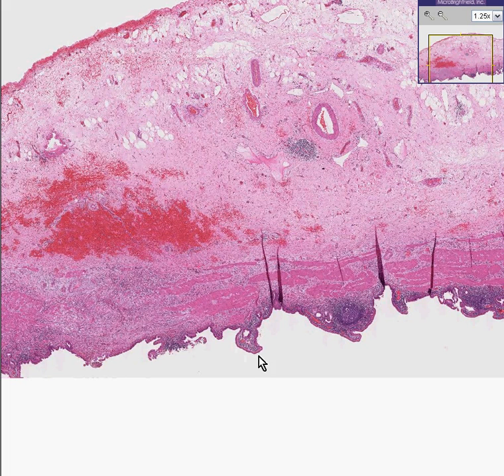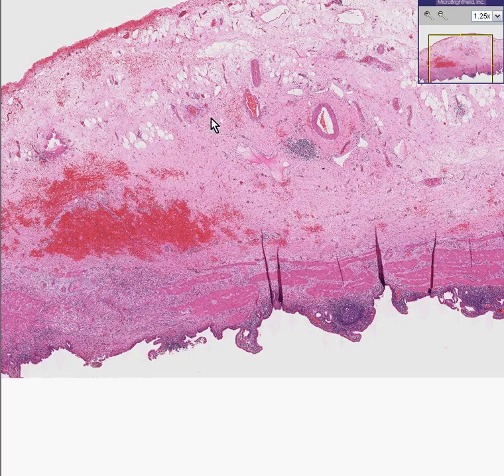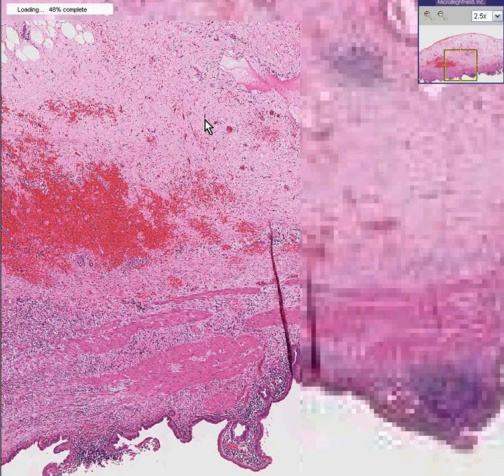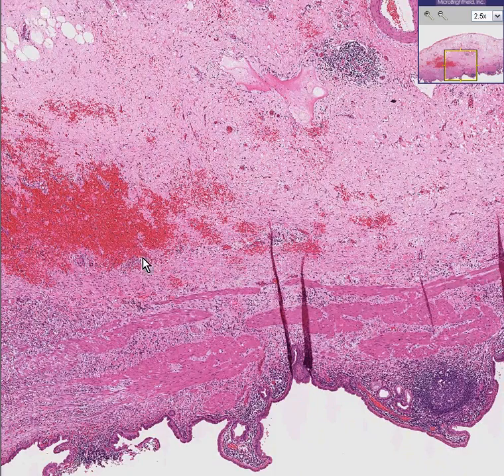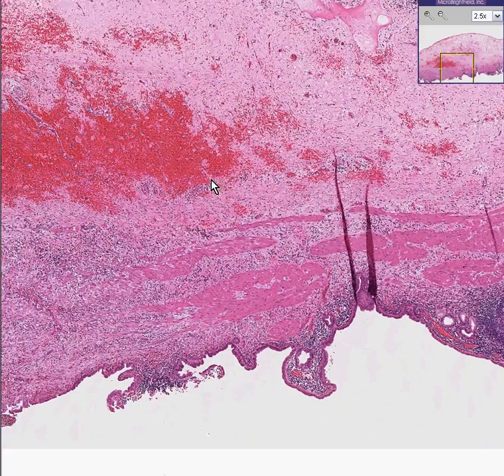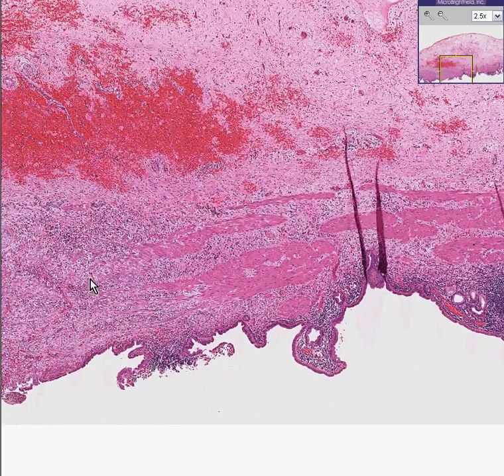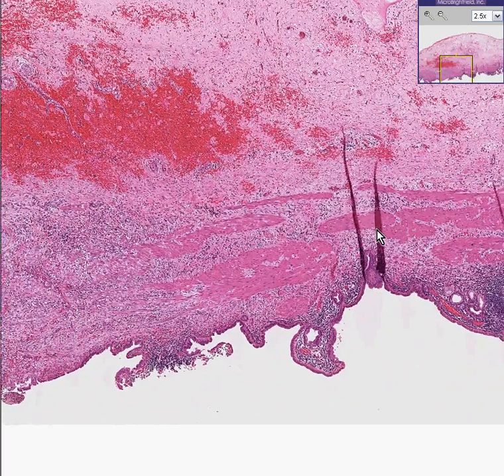The mucosa is fairly columnar and may form little papillae like this, which is classical for gallbladder. You take this gallbladder, throw in a bunch of lymphocytes, and you have your diagnosis of chronic cholecystitis.